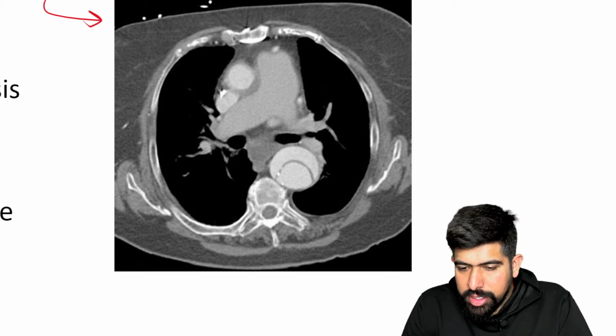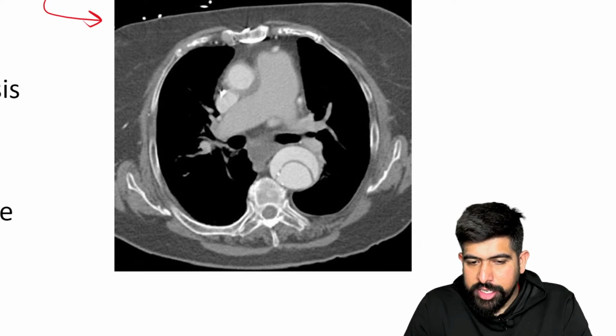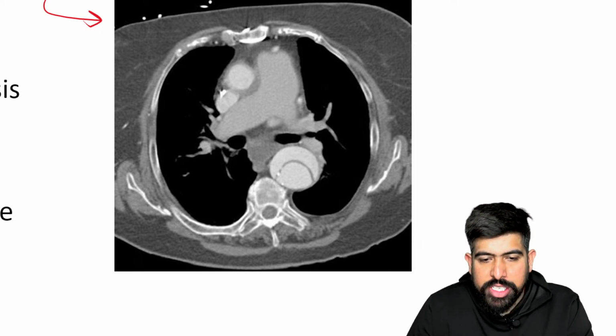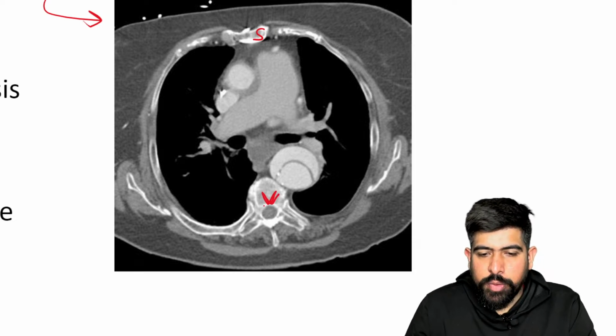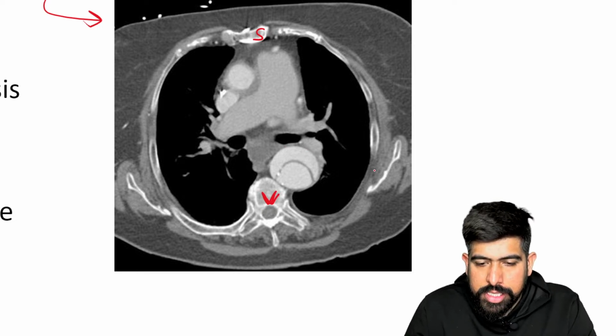I hope you clearly see this. Now can you make the diagnosis of it? Can you tell what structures are seen in this condition? I'm mentioning some things. This is your sternum. This is your vertebra. These are your lungs. And this is your important structure, I'm marking here, this is your aorta.